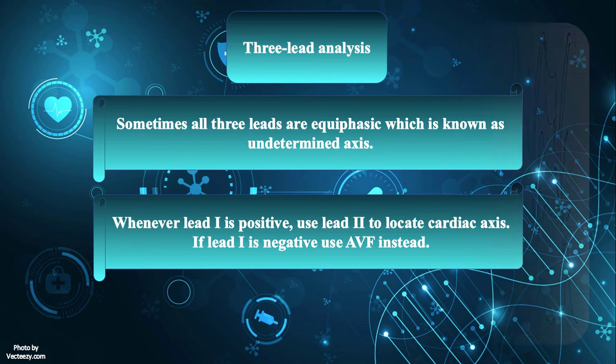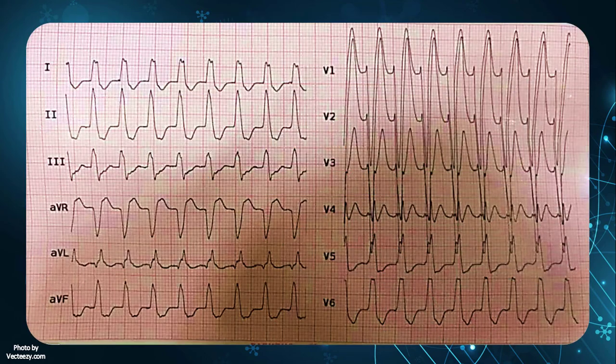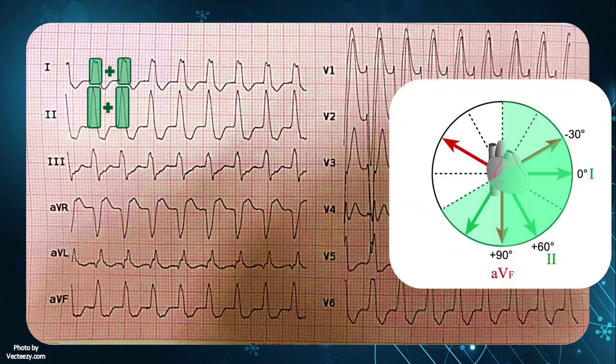In our first example, QRS complexes in both leads 1 and 2 are upright and positive. Therefore, the axis is within normal ranges.